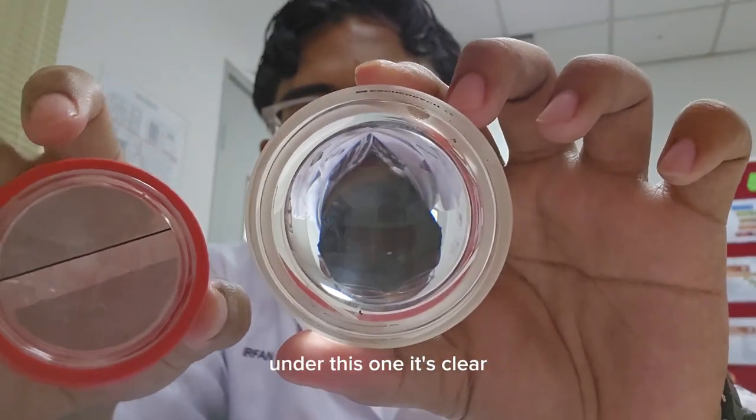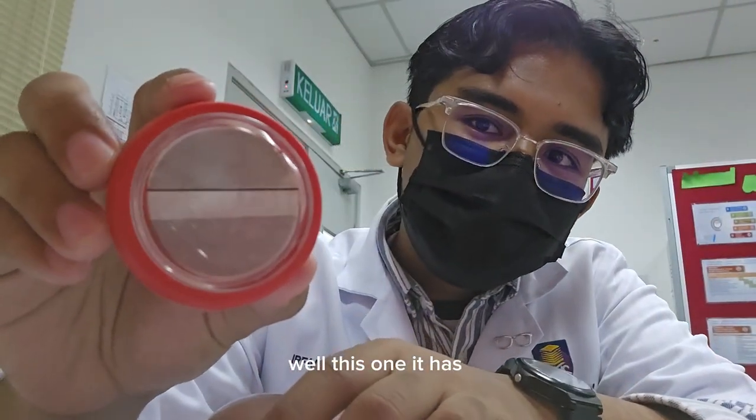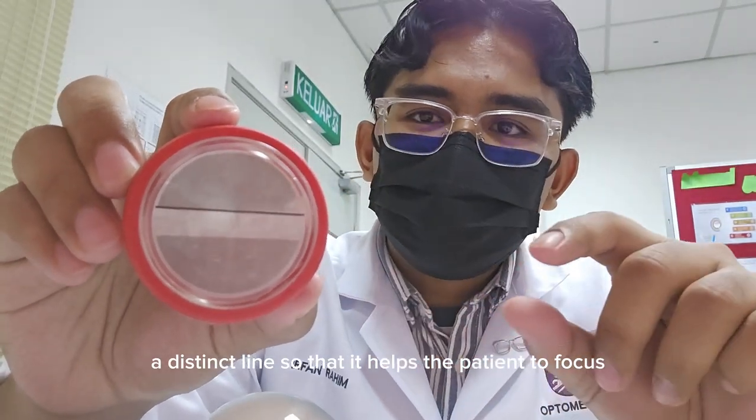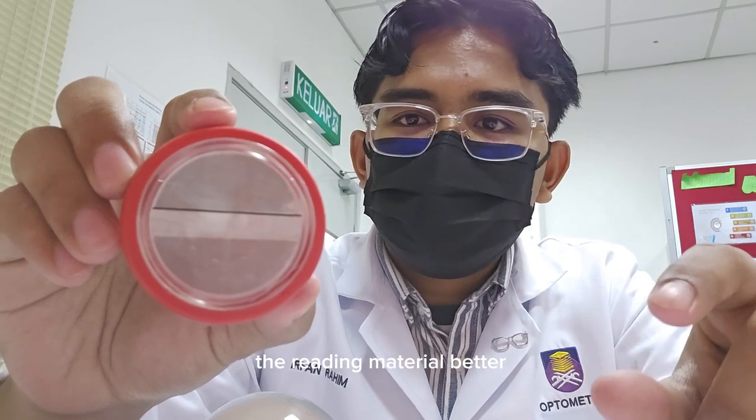Under this one, it's clear, while this one has a distinct line, so that it helps the patient to focus on the reading material better.